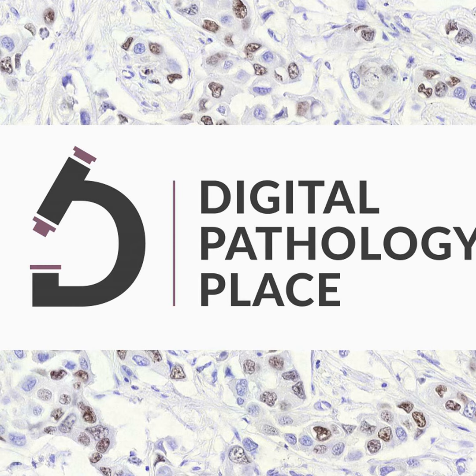The same year also witnessed the first public demonstration of the robotic microscope. A pathologist based in Washington, D.C., remotely controlled a microscope stationed about 2,000 miles away in El Paso, Texas, to evaluate and diagnose a breast biopsy. This landmark event was a resounding success, marking a hopeful and promising beginning for a novel medical field.